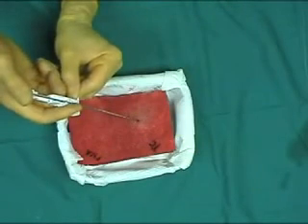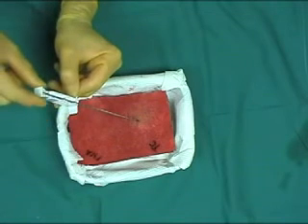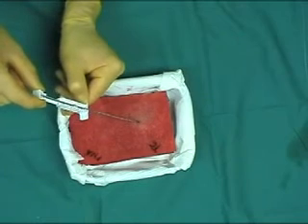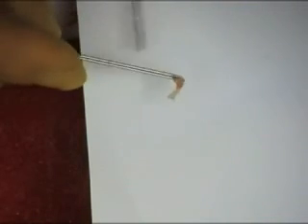The central part is then stabilized while the outer sheath is advanced. The entire needle is removed from the specimen.